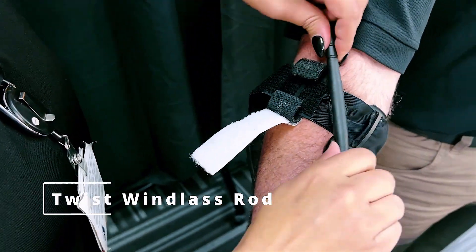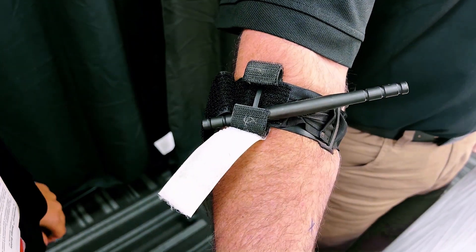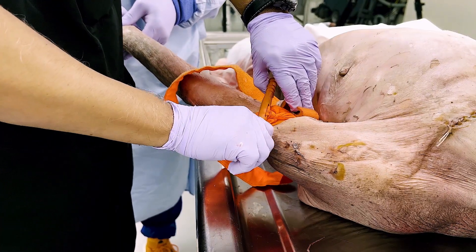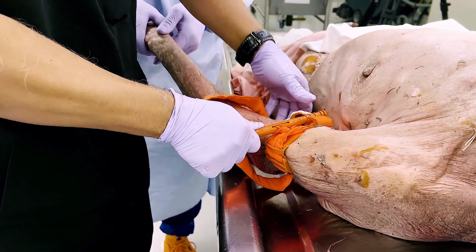Twist the windlass rod until bleeding has stopped. The windlass should not be turned more than three times, with each turn defined as a 180-degree spin. If more turns are required, the tourniquet was not tightened enough when initially applied around the extremity.